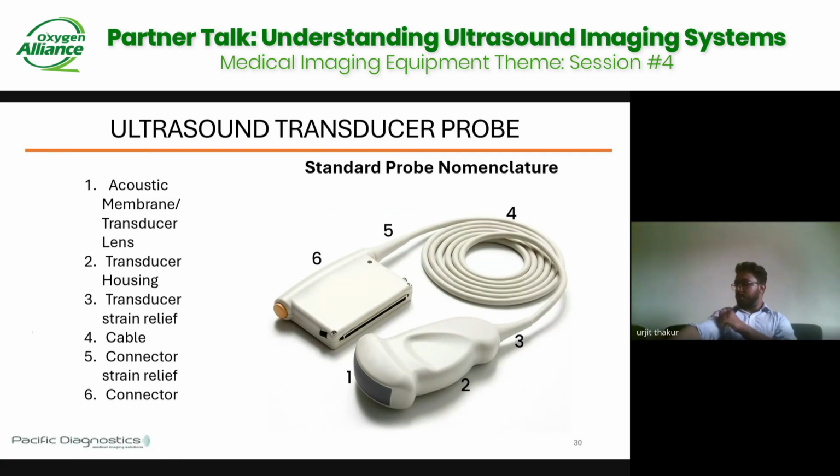This is the basic architecture of how the ultrasound transducer probe looks. As number one, you have the acoustic membrane. Behind this is where the crystal is, the piezoelectric crystal, as I said.